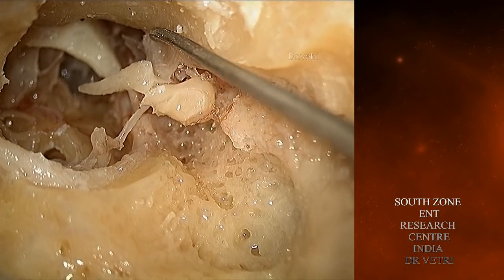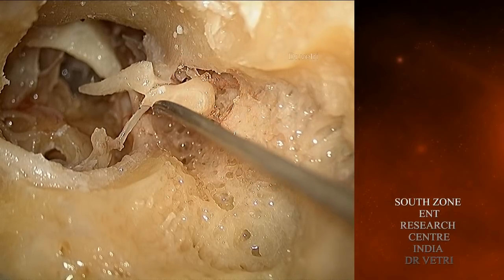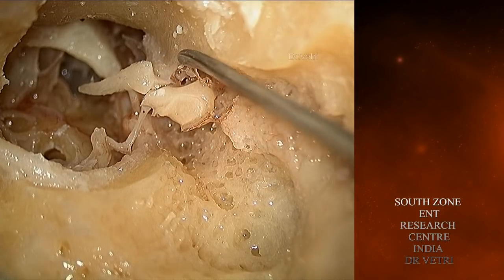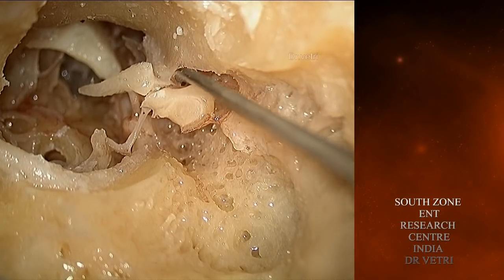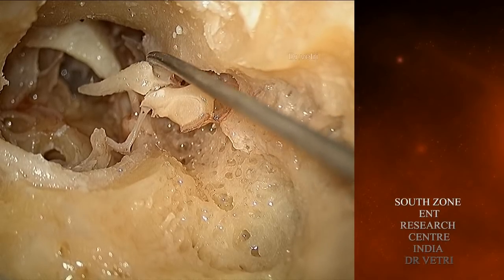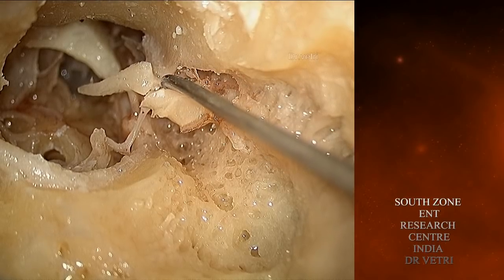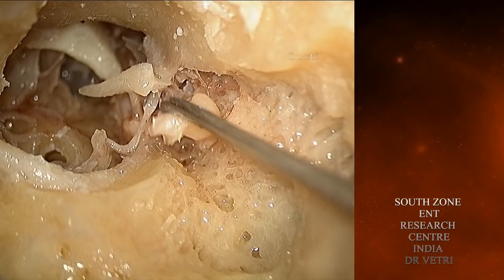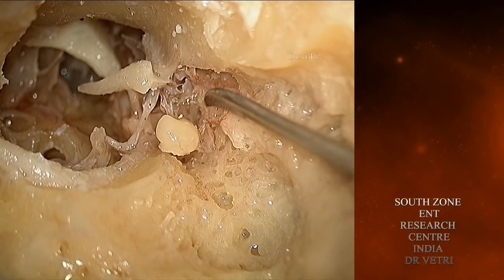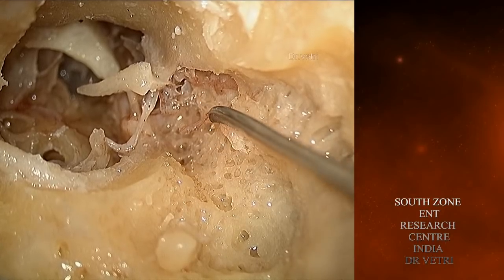Still the scutum in the anterior part is intact. The Prussak's space has now been opened. And once you remove the head of the malleus, you have complete access towards the anterior epitympanic space.